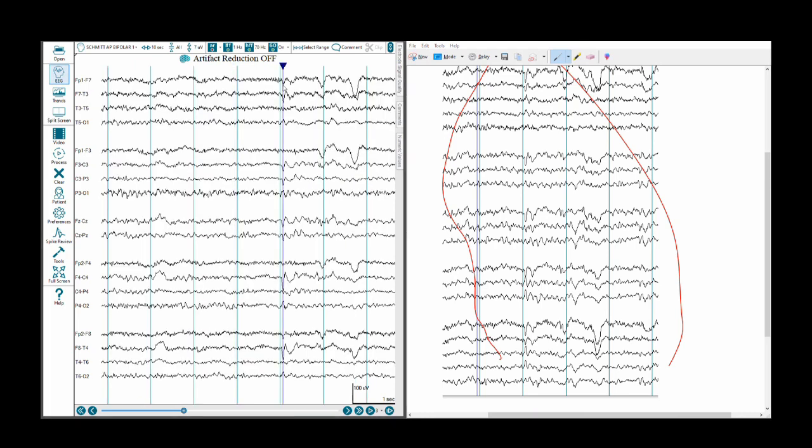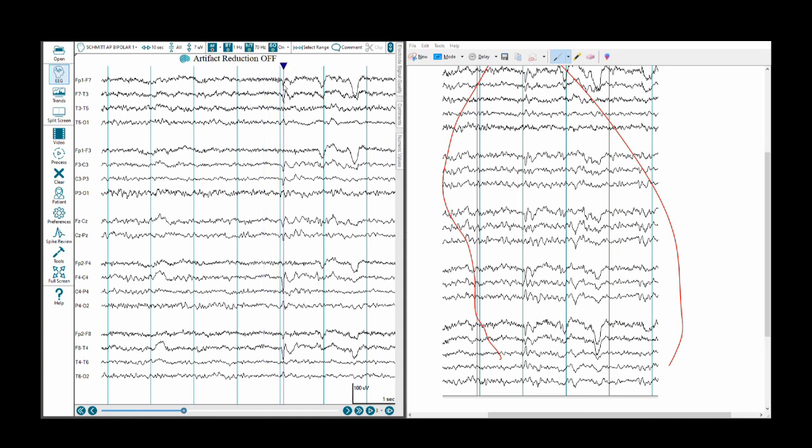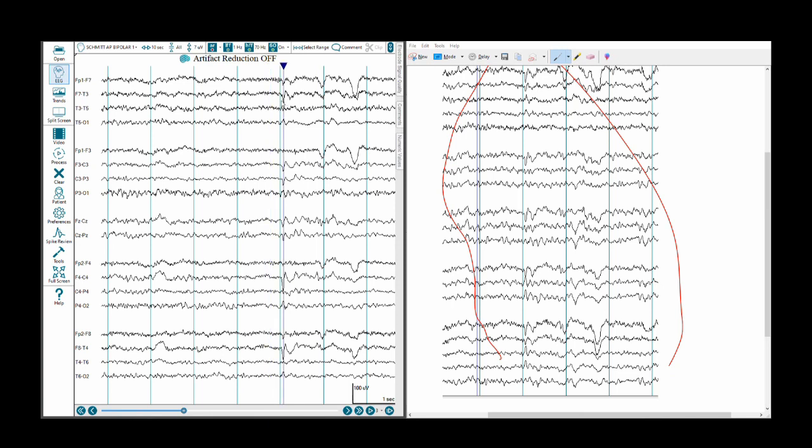In the FP1, F7 channel, the frontal region is more positive. F7 will be more negative than FP1, perhaps because the dipole is oriented. We are looking to stitch in or incorporate the logic of this positive dipole. FP1 is really recording this positive charge. It is in input 1, it is more positive with respect to F7, so there is a downward deflection. F7 itself is more positive than T3. It is closer to the maximum of that positive dipole component. Not much at T3, T5. T5, O1 is showing a bit of an upward deflection.